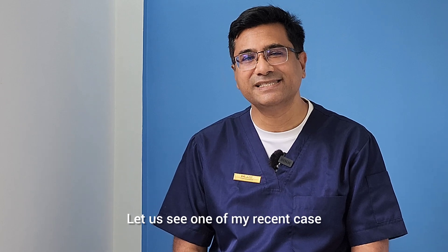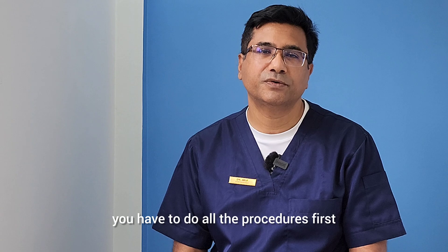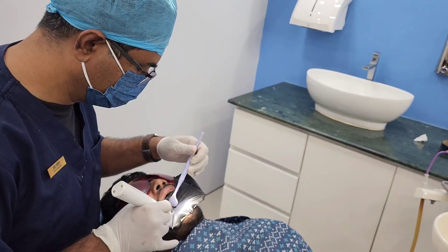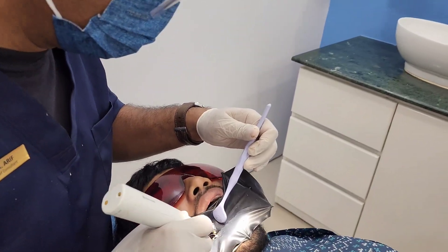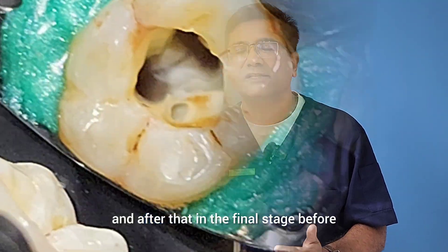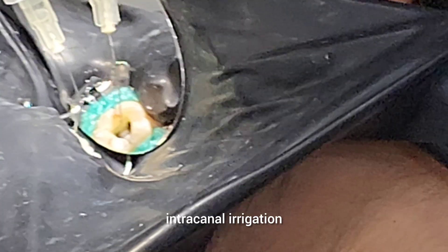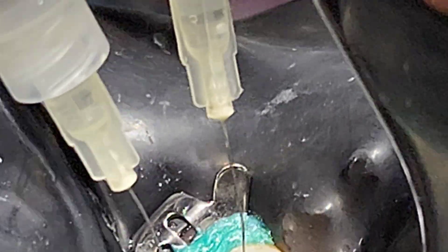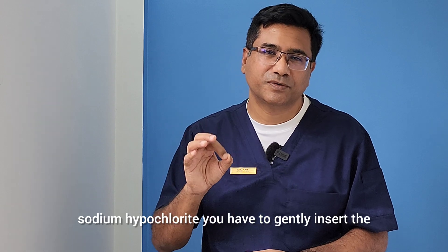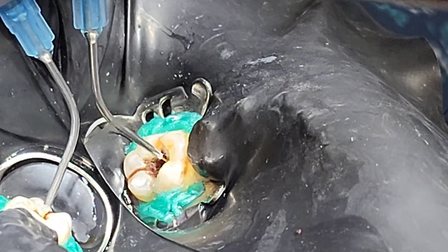Let's see one of my recent cases. In this case we performed the root canal procedure in a single sitting. For the disinfection part by laser, you have to complete all the procedures first — maintain proper isolation with rubber dam, remove the pulpal tissue, prepare and shape the canals, clean all the debris, and then in the final stage before obturation, put a favorable intracanal irrigant. We usually use six percent sodium hypochlorite.